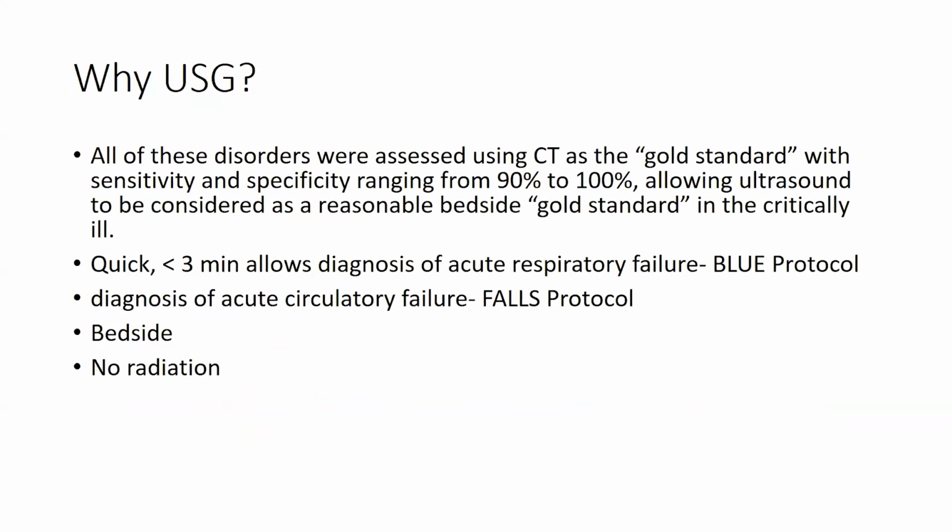But why are we focusing so much on USG? All of these signs that we just saw were assessed using CT as the gold standard, and the sensitivity and specificity of these signs have ranged from 90 to 100%. So it is a reasonable bedside gold standard.